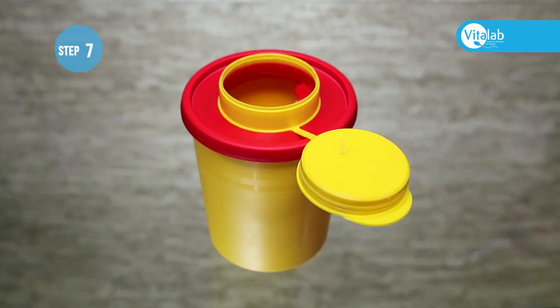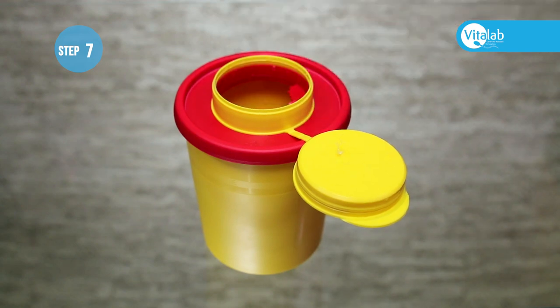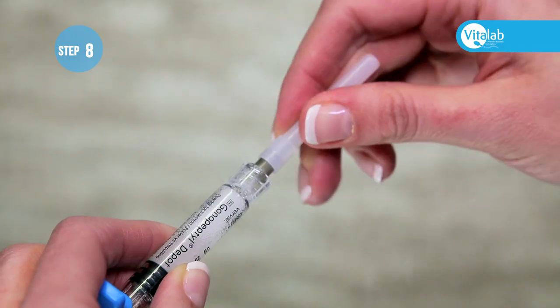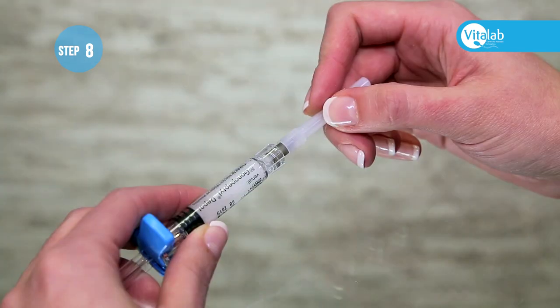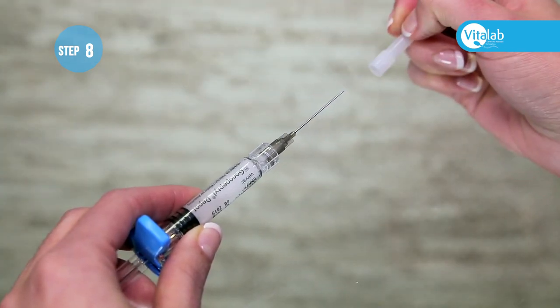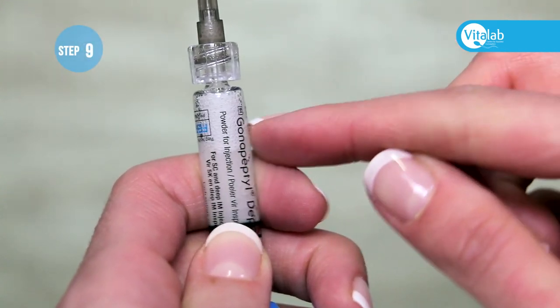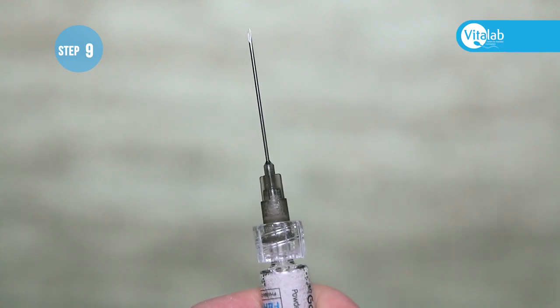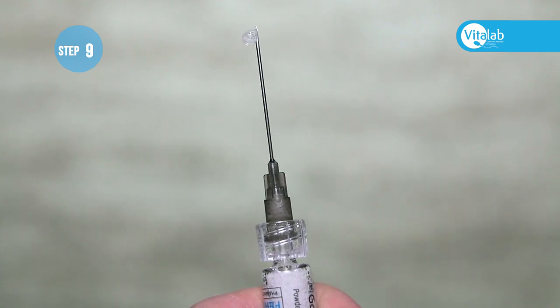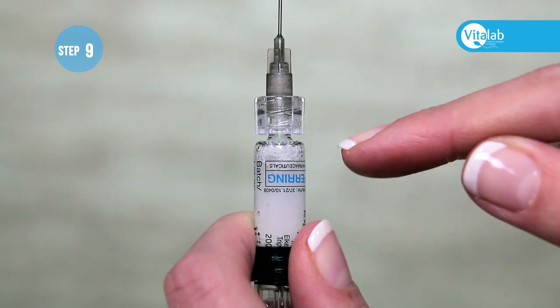Discard the empty syringe and connector in the sharps container. Screw on the needle tightly. Remove the cap from the needle, hold the syringe upright while tapping it gently, and push out some of the bubbles. Do not push out too much medication — it does not matter if there are still some bubbles left in the syringe.